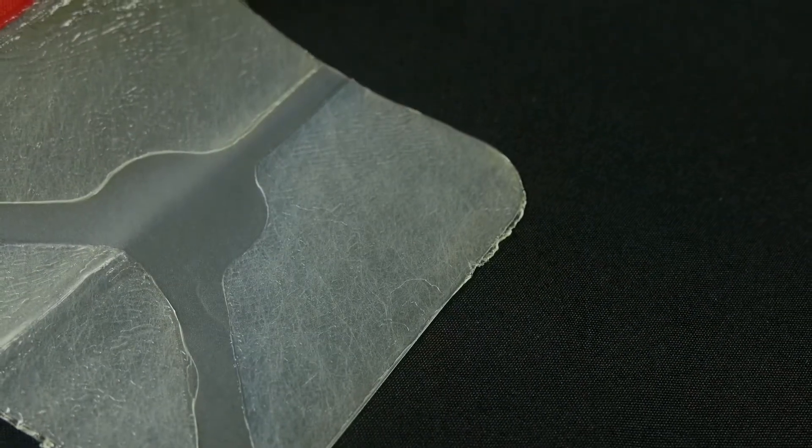A final note on chest seals: if we place a seal on a patient's chest and they have a collapsed lung, there's a chance for air to get trapped inside the chest wall and collapse that lung even further. We want to monitor this patient, and if their breathing seems to get worse, we may have to peel back the corner of that chest seal — what we call 'burping' the chest seal — to allow some of that air to escape. That's the beauty of vented chest seals: they automatically do that for you.